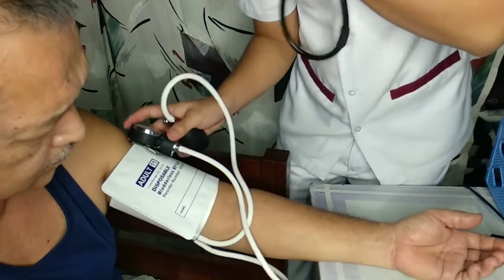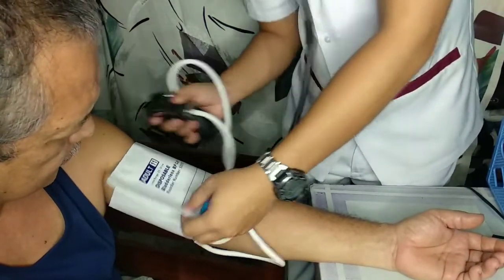Okay. Sir, your blood pressure is 120/80. So you have 5 Korotkoff sounds that you would hear when measuring a blood pressure. Phase 1 is the sharp thud. The next is your swishing sound. Korotkoff sound 3 is your softer thud. The fourth is the muffled sound, and the fifth is the silent.